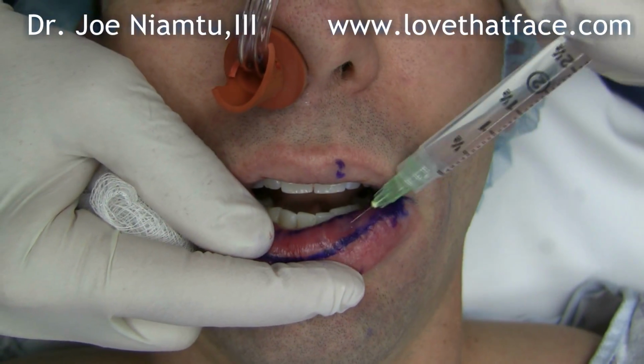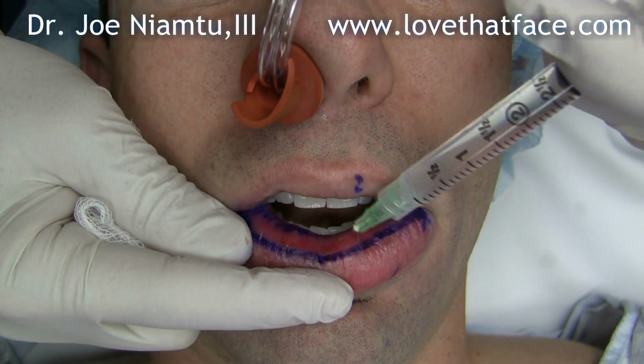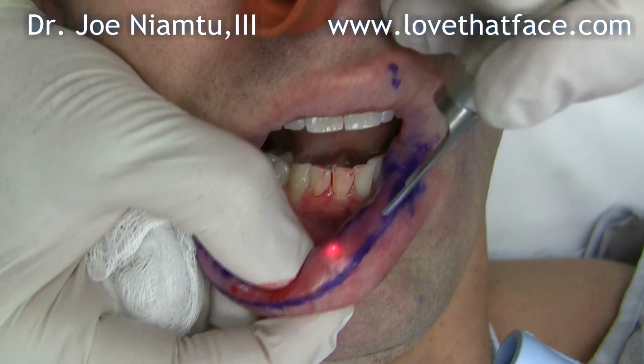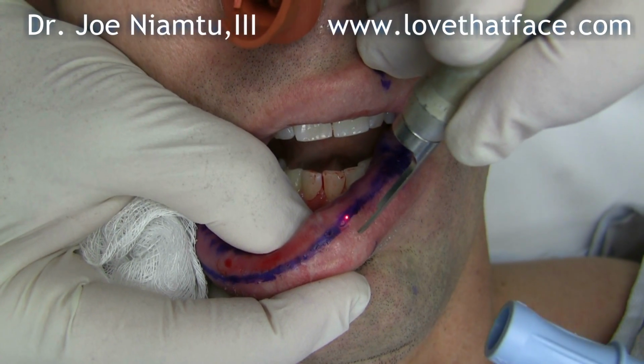We're going to use some local anesthesia. We're doing this under IV sedation. It can be done under local, but we prefer to do it under IV. About the laser is there's virtually no bleeding, so we're going to make our laser incision with the Lumenis CO2 laser.